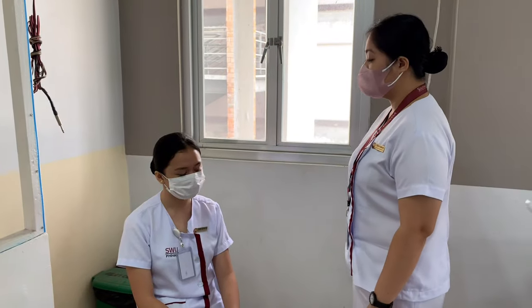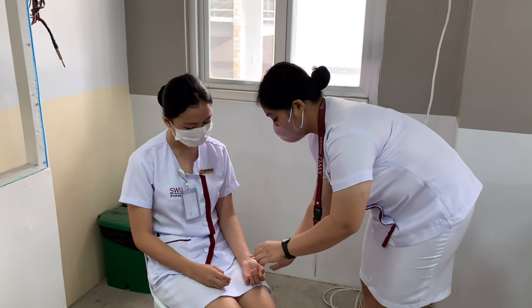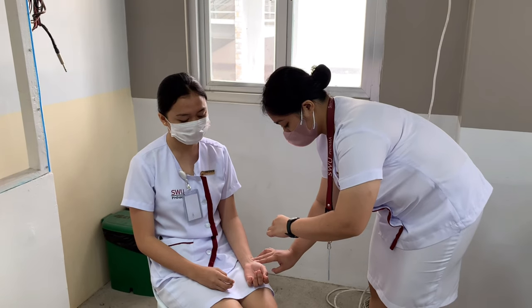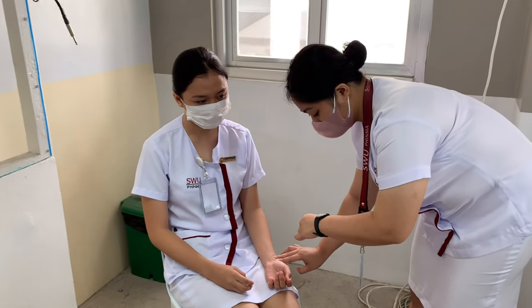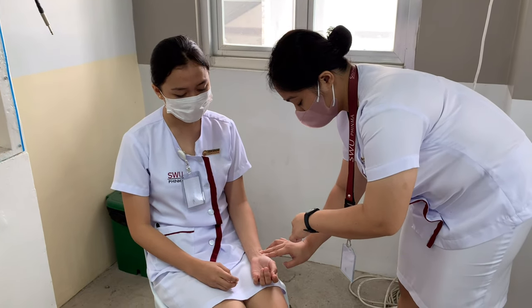In taking the pulse, position the client so that their arms are relaxed and supported. Place fingertips — index and middle finger — on the inner surface of the wrist. Fingertips are sensitive, facilitating palpation of the pulsating artery. Compress the artery gently so that it can be felt distinctly. This stabilizes the wrist and allows pressure to be exerted.